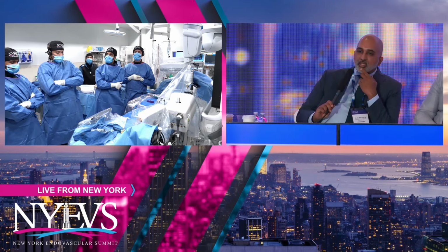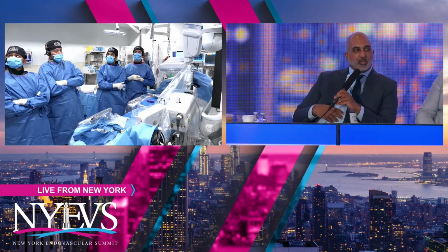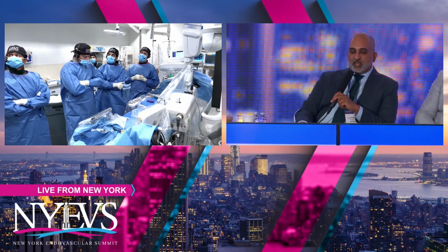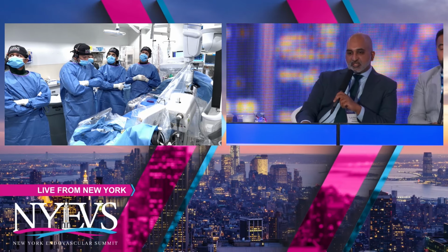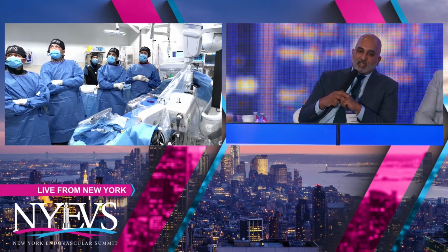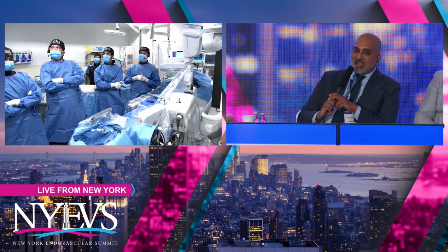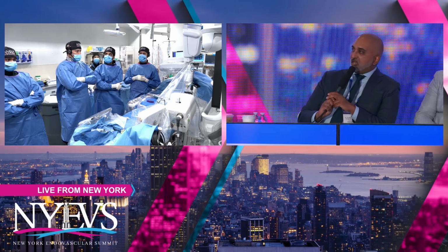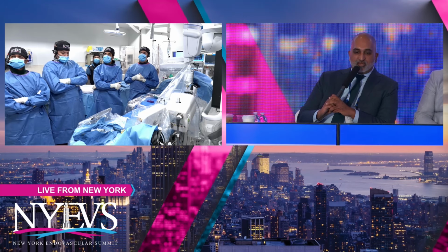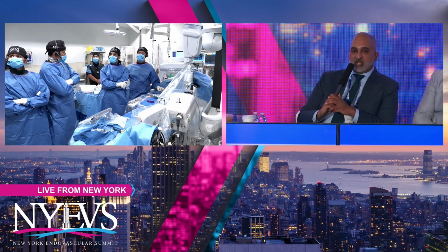So, I noticed that once you pop through that proximal cap, it looks like the wire crossed relatively easily. So one thing that I would do, instead of trying to go through that channel beyond the stent, is actually treat the stent first and then cross, using the stents as its own filter. My concern is that there's a big soft core of hibernating thrombus, a really soft plaque that could embolize. Possibly the Rotarex will take care of some of that. I myself, and I think Kumar sometimes too, will do a thrombectomy of that first before we treat. And I think that removes a lot of that stuff that could potentially cause complications as well.